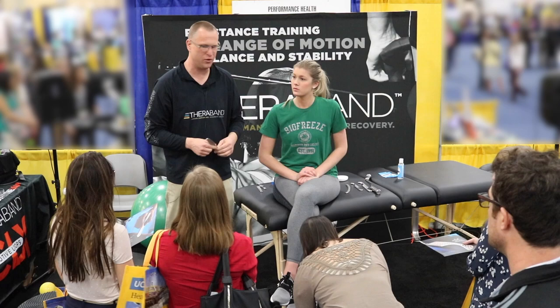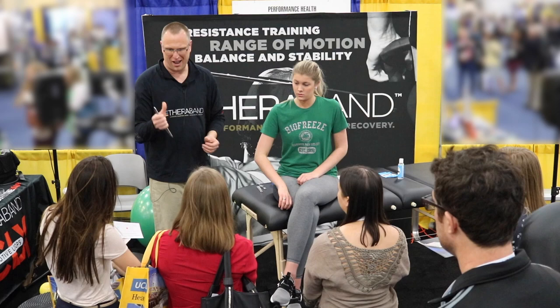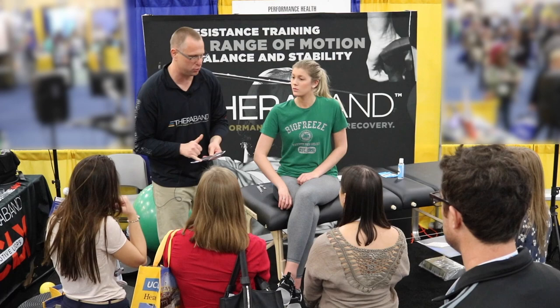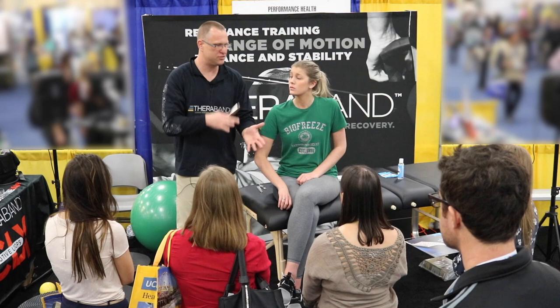The first question I always get when I do augmented soft tissue is: why am I utilizing an instrument versus my hands? The answer is more specificity. When I approach a patient with my hands, I'm using a broad surface of force against a broad surface of the body. With an instrument, I'm driving force through a smaller mechanical area — all instrument companies design a beveled edge to bring that force to a specific point.